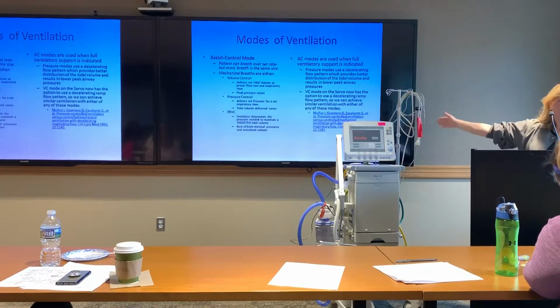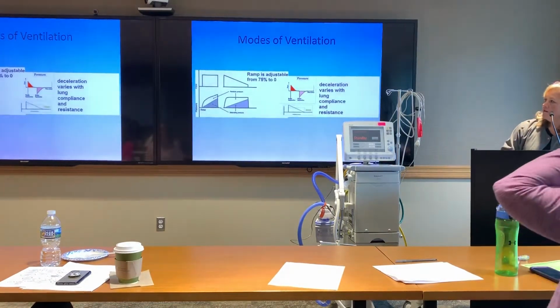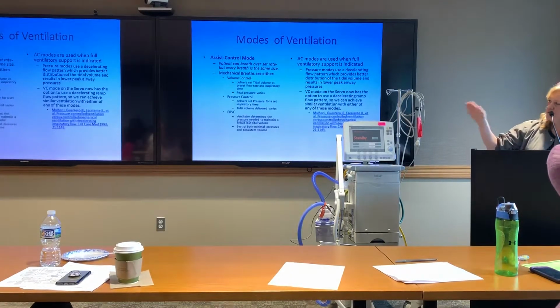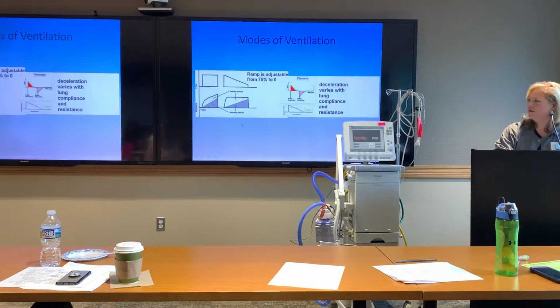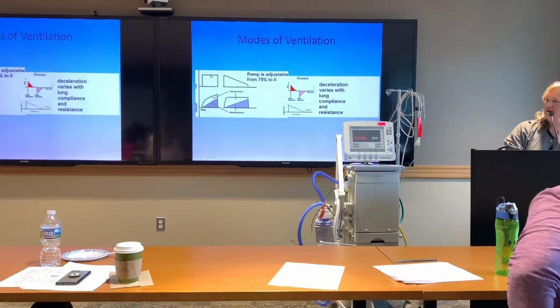That's a little citation that will basically say all of that. All right, so modes of ventilation. In volume control ventilation, which is what I'm just seeing. Oh, I forgot I have an error here. Old days, volume control was only done with this flow pattern, which is really uncomfortable.